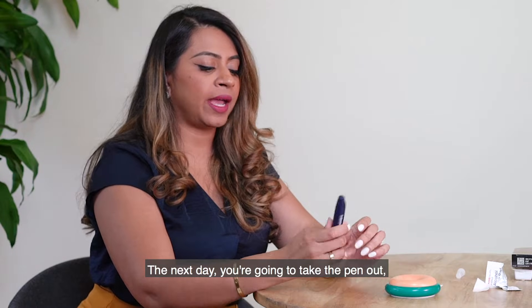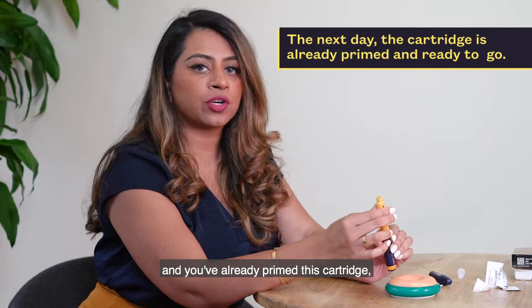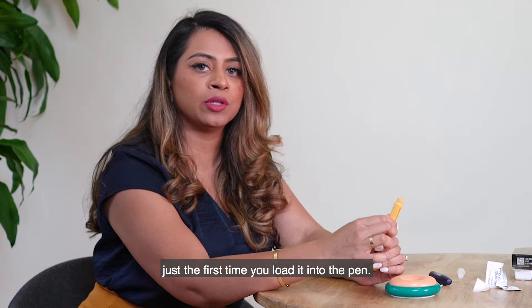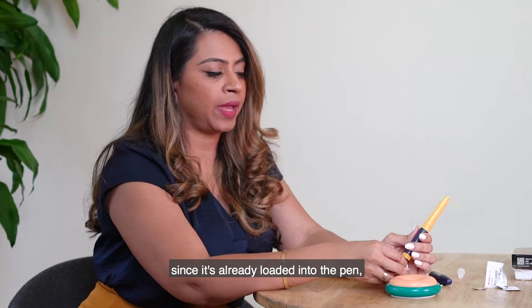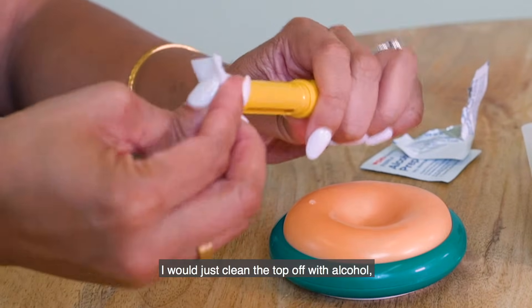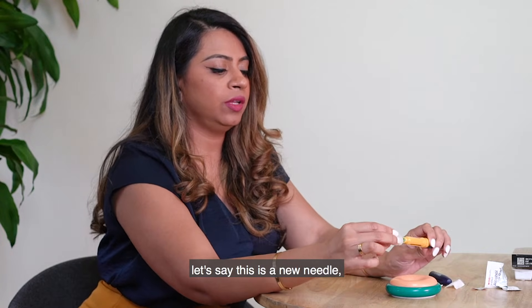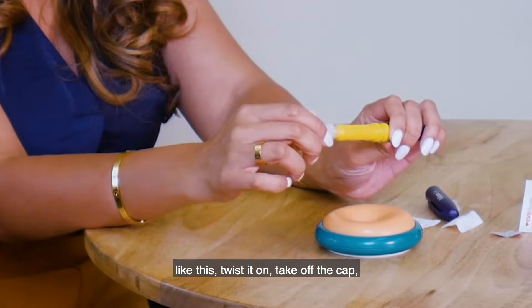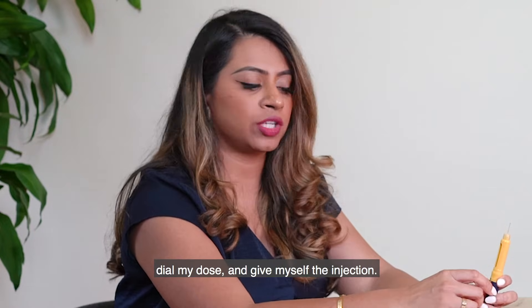The next day, take the pen out of the fridge and remove the cap. Since you've already primed this cartridge, you don't have to prime it every single time — just the first time you load it into the pen. So on subsequent days, with the cartridge already loaded, just clean the top off with alcohol, take out a new needle, place it on top of the pen, twist it on, take off the cap, dial your dose, and give yourself the injection.